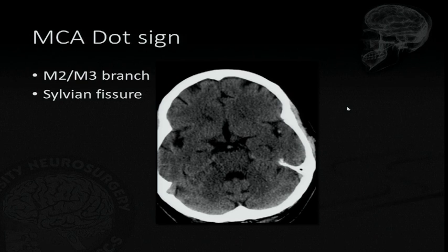If the patient has right side weakness, aphasia, or dysarthria, you're going to look at your left hemisphere, left MCA and basilar artery, okay? Left side weakness, you look at your right MCA and the basilar artery. Always look at the basilar artery, okay? It doesn't matter what side the symptoms are, because those are very vague and they can include both sides. So the MCA on the side that you think is affected, the basilar artery, and your cervical carotid on the side that you think is affected.